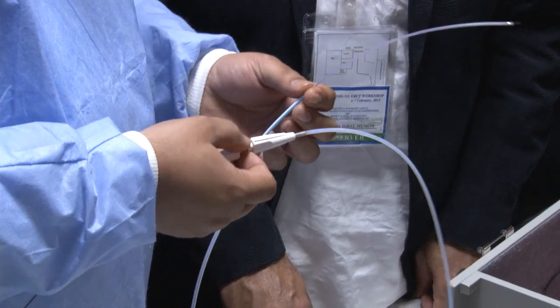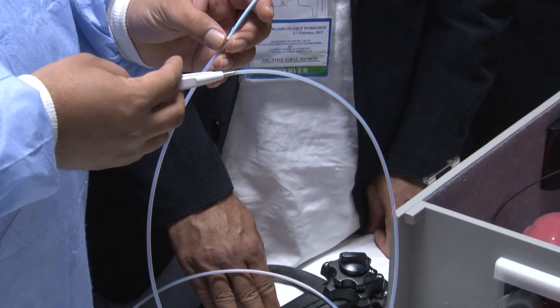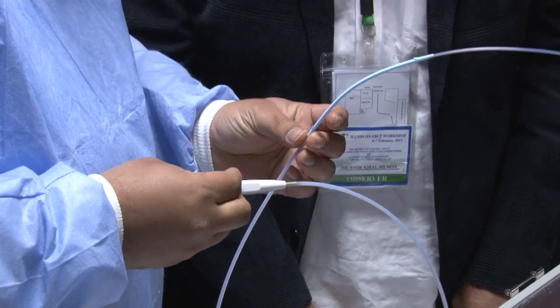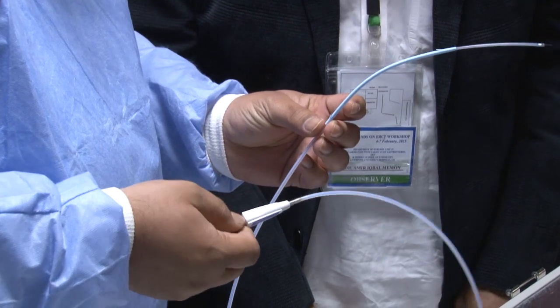Sometimes big stones come up. We all have had that experience. So I do a good sphincterotomy. I try and take the stone out otherwise, and when it doesn't, then I do a sphincteroplasty. In a very small number of cases, I would actually go in saying, oh, I have to do a sphincteroplasty because the stone is very big.